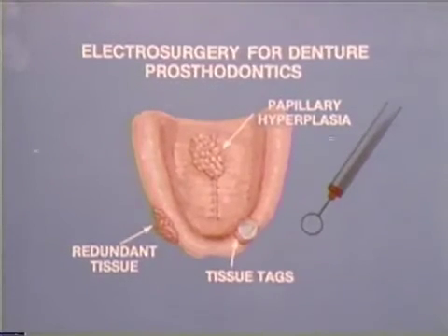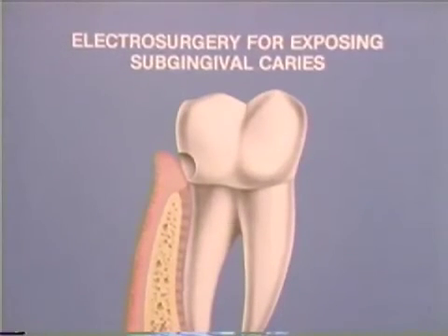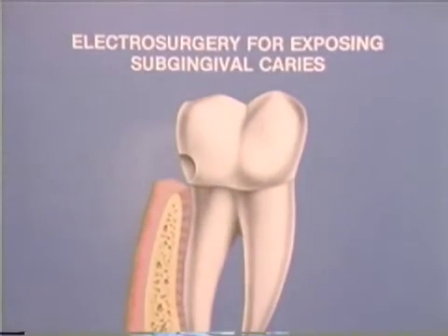Electrosurgery is also quite useful in denture prosthodontics for removing papillary hyperplasia, tissue tags, and redundant tissue. Additionally, these basic procedures are useful when exposing subgingival caries prior to restorative procedures. This surgical procedure relies on the same principle of bone avoidance by forming an arc around the bone with sequential cutting strokes. The first cut forms a trough while cuts two and three form the arc, resulting in increased access for tooth preparation, restoration, and correct tissue contour after healing.